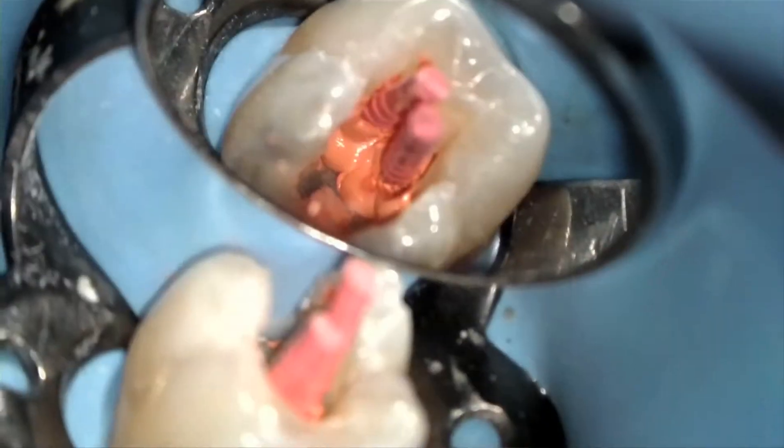The removal of excess gutta percha in the pulp chamber and of the gutta core carrier may seem messy and difficult, but it's actually quite easy and one of the great features of the gutta core system.